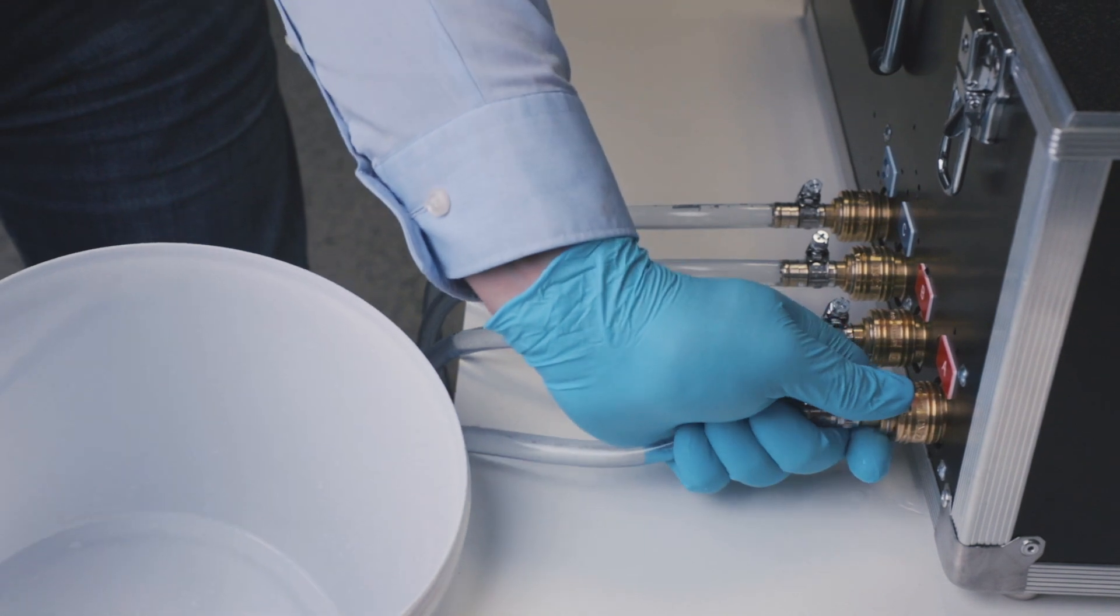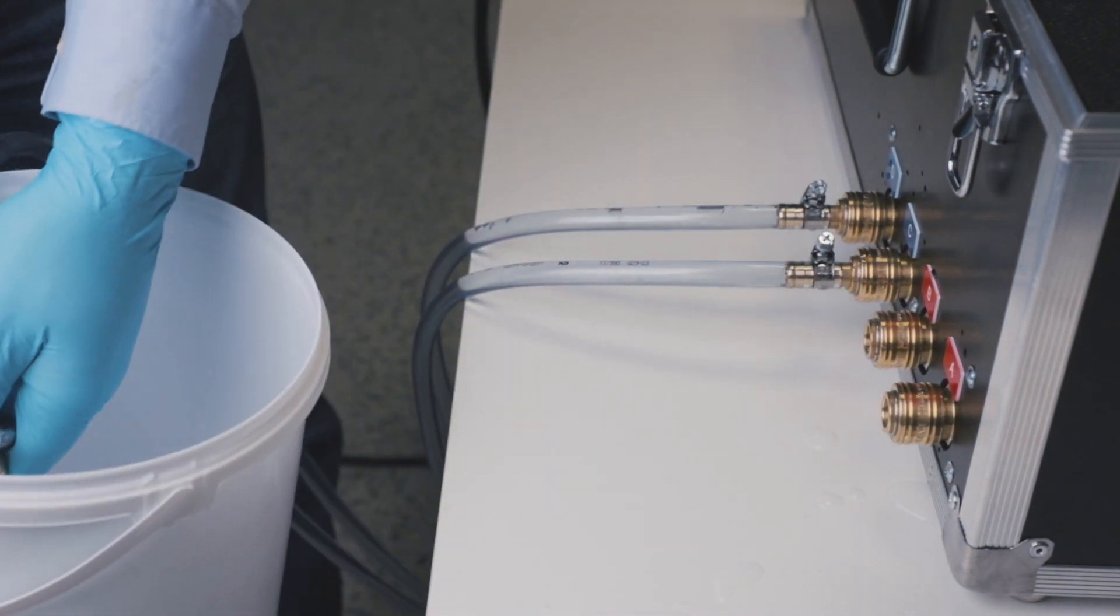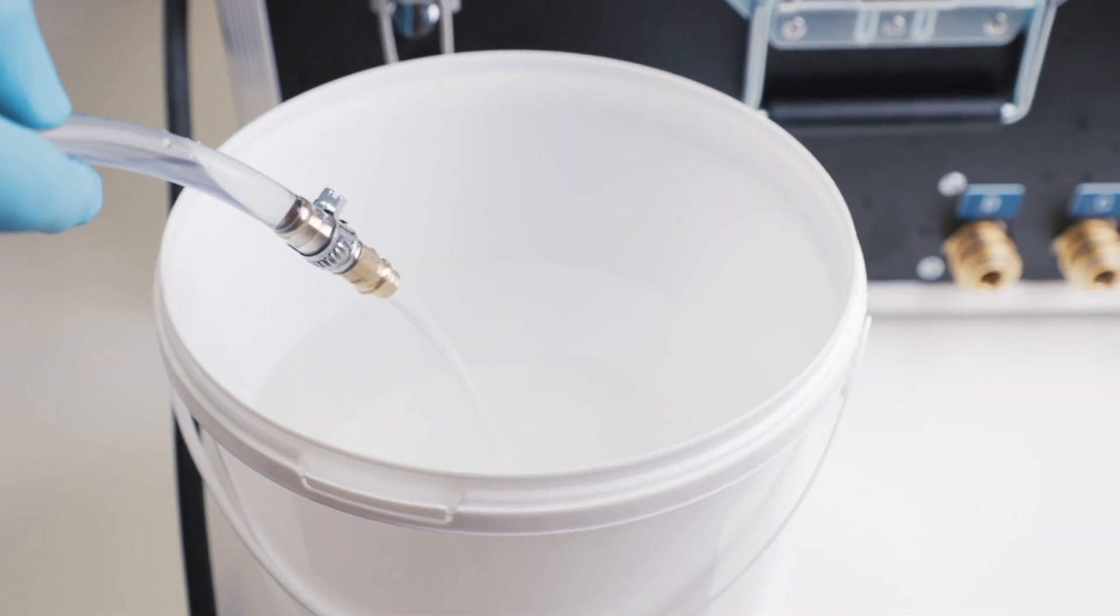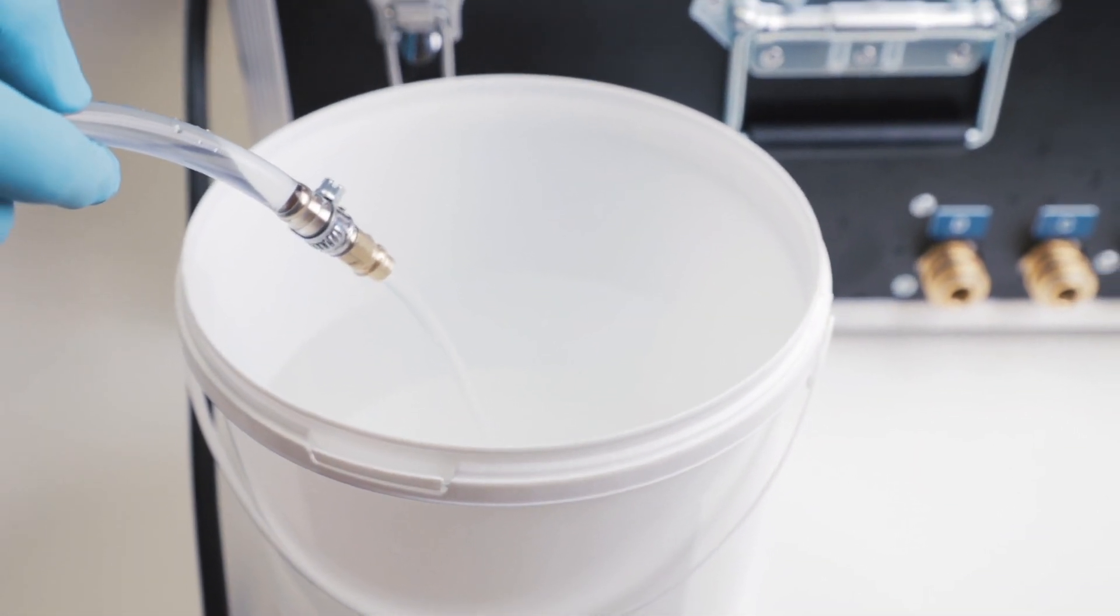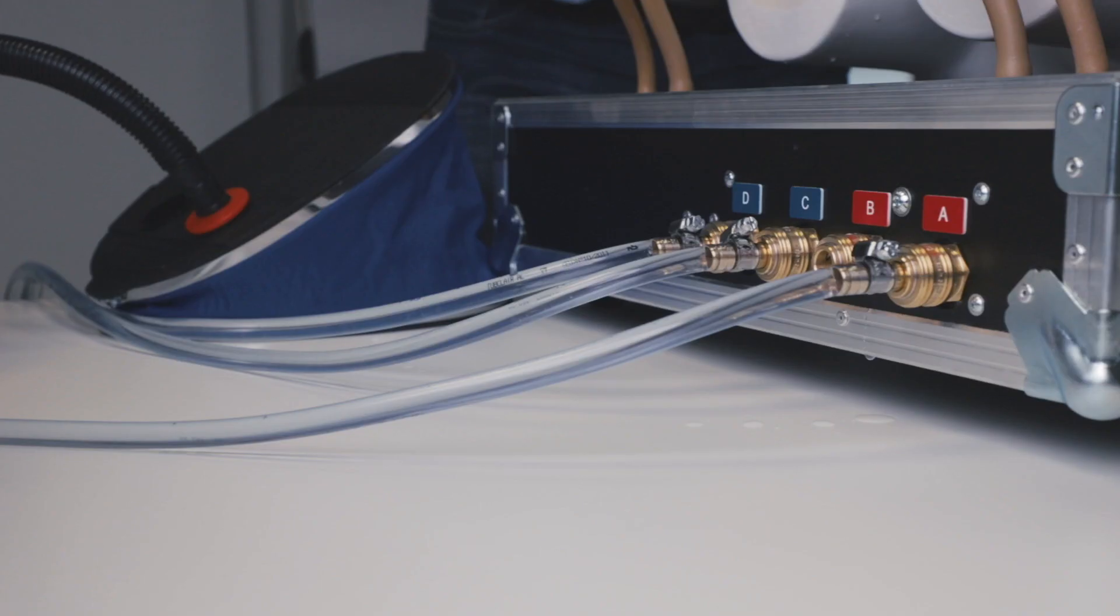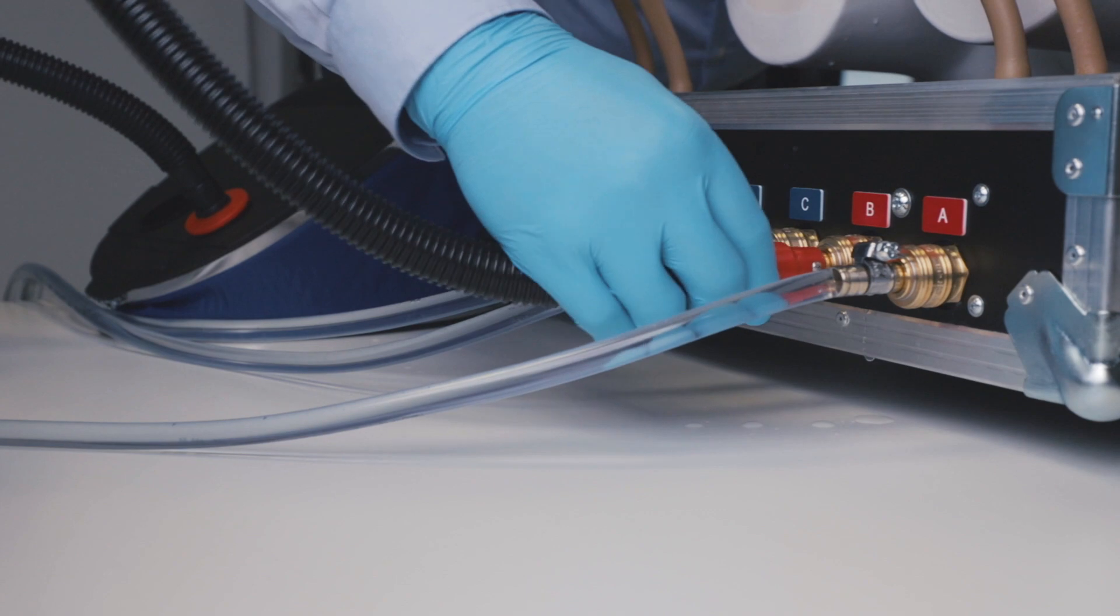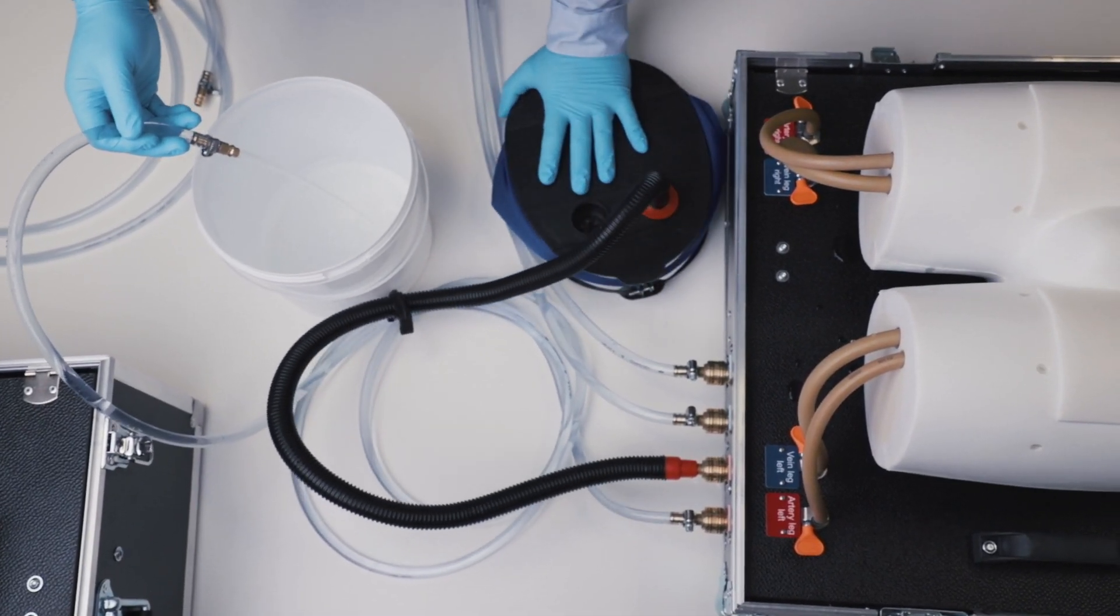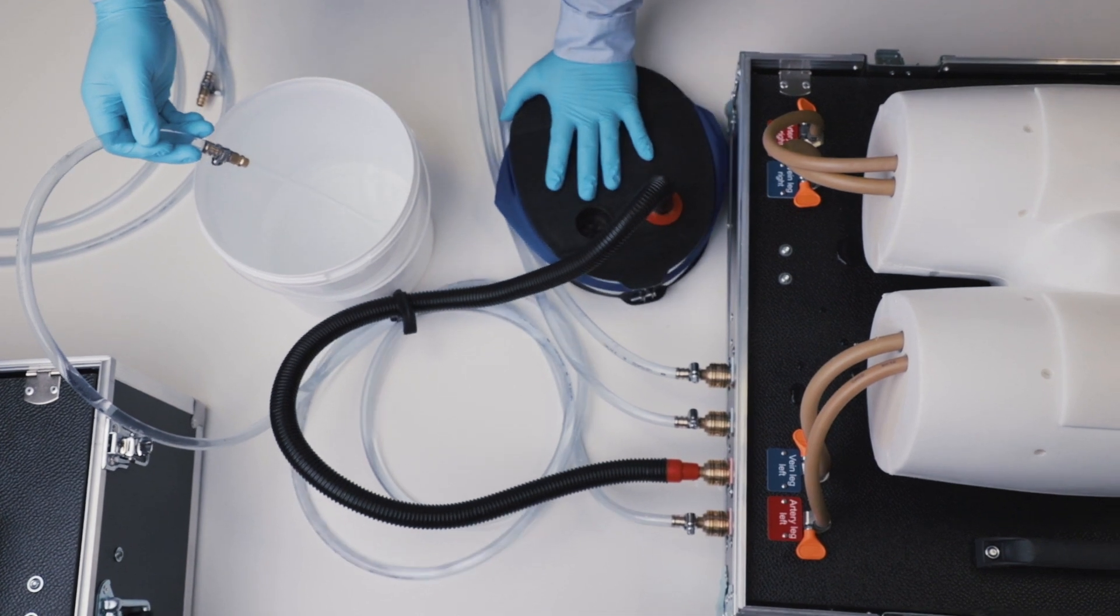Remove tubes A and B from the pump case. Put one tube end in a bucket so that the water can flow out. Remove the other tube and connect the air pump. Pump air into the tube to remove all water and do the same procedure with circuits C and D.